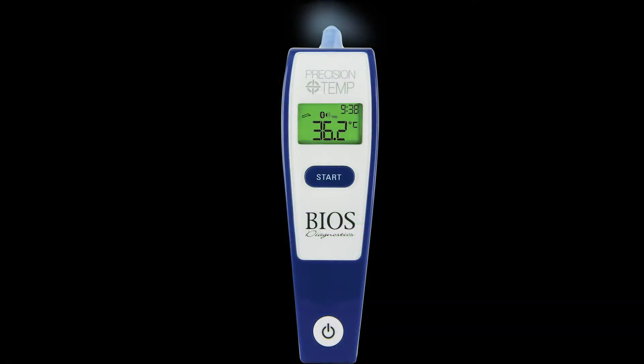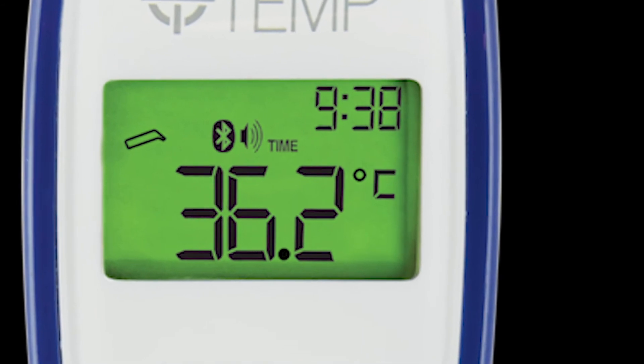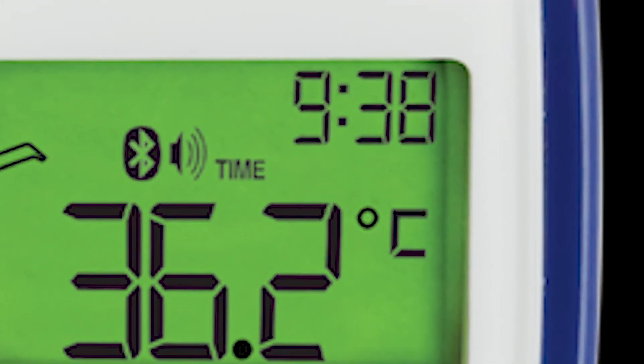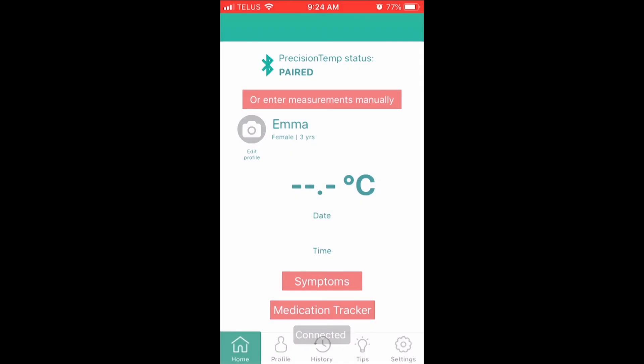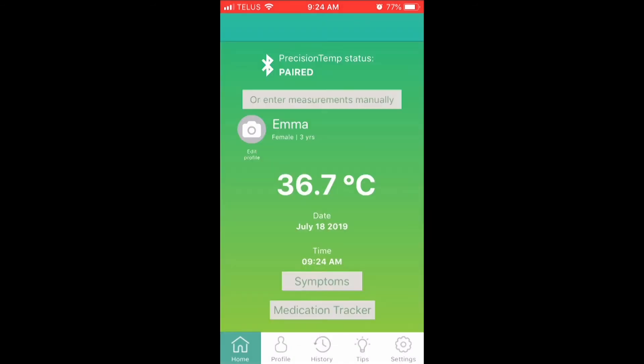It is important to note that the date and time needs to be set correctly on your Bluetooth ear thermometer. Otherwise, when you download the measurements to the app, they will not appear in the history measurement section. Once the fever measurement is downloaded onto the home screen, you will see the temperature taken with a date and time stamp. The screen will also change colour — red indicating a fever, or green indicating that no fever is present.